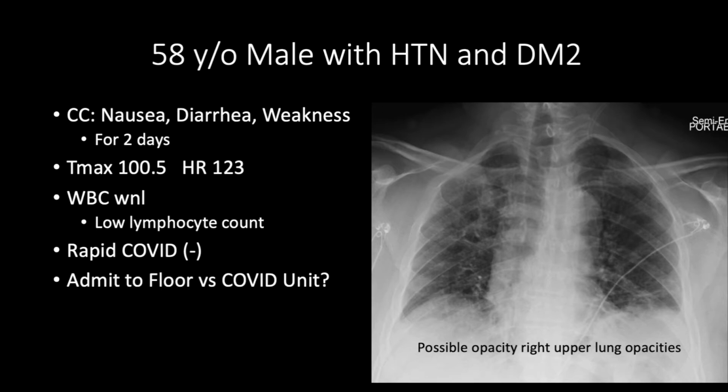So the question that we were asked is, can we admit this patient to a regular floor bed, or do they have to go into a special COVID team and special COVID isolation unit? So I suggested, why don't we clarify what's going on in his lungs with ultrasound to see if that can shift our pretest probability of COVID in this patient.